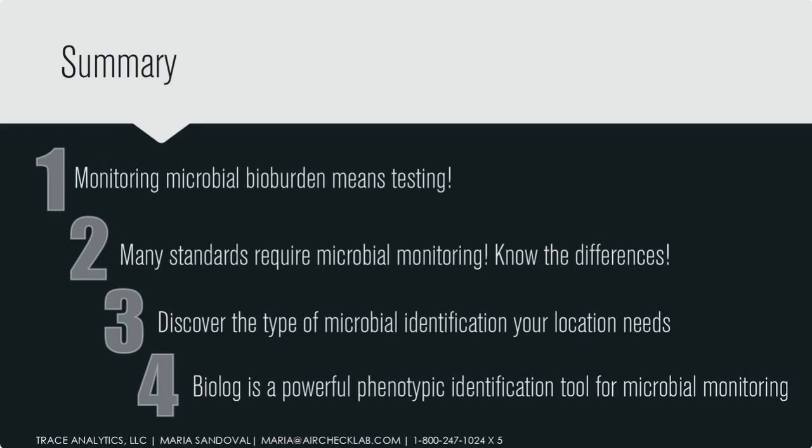A lot of these standards require microbial monitoring, so you need to know what type of difference there is: presumptive, confirmatory, or do they just want a number? Let me give you an idea. ISO 14698 requires confirmatory identification, but they give you the leeway to figure out what type of confirmatory identification you can do.